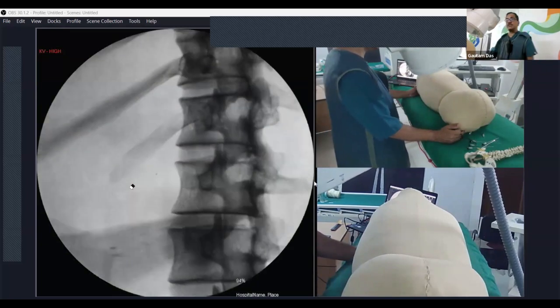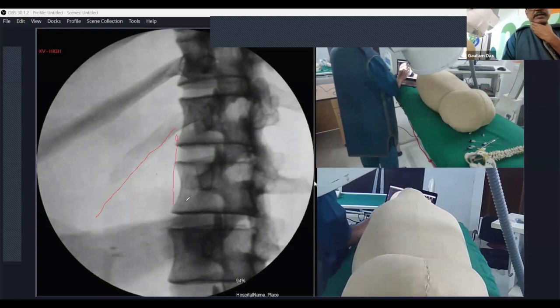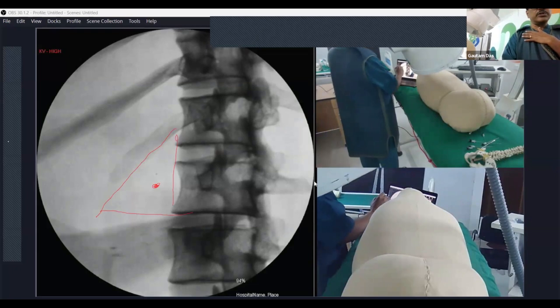Okay, now the transverse process is buried inside. So now I have to imagine a triangle there. The triangle is bounded by this line, medially by the vertebral bodies, and then we extend it. And here, if I am putting the needle there in tunnel vision, I'll be going through and through the aorta. This was our hypothesis. We published it. I'll be showing this literature with you.